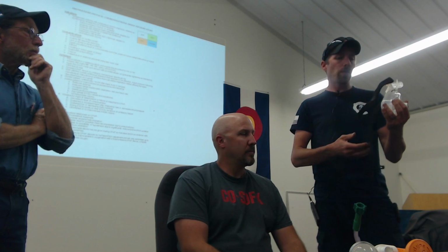What we're going to do, though, before we hook any of this up is make sure that we're flowing. We don't want to put this on the patient's face unless there is air flowing. Two reasons. One, we don't want to take them off the non-rebreather and then be fiddling around for 30 seconds to a minute or more getting this thing all hooked up and we're not giving the patient any oxygen. Two, you don't want to induce more claustrophobia because then they're having to breathe the dead air space through this tube, through that release valve. So we want to be supplying that air before we put this on their face.